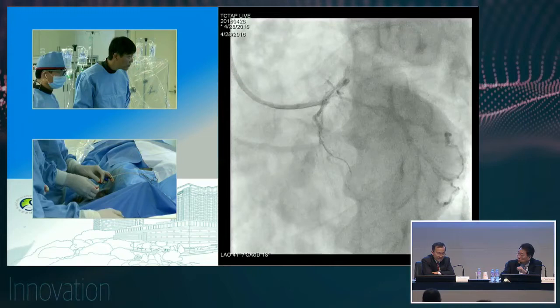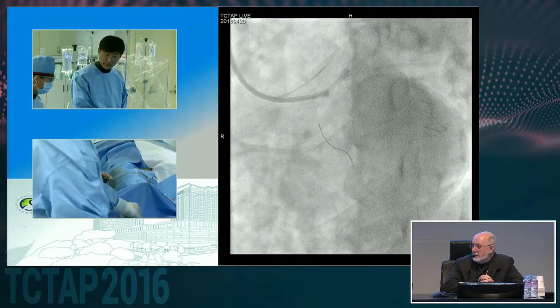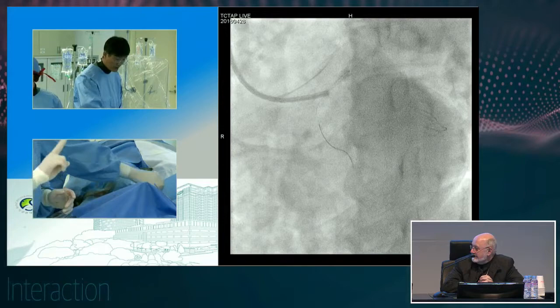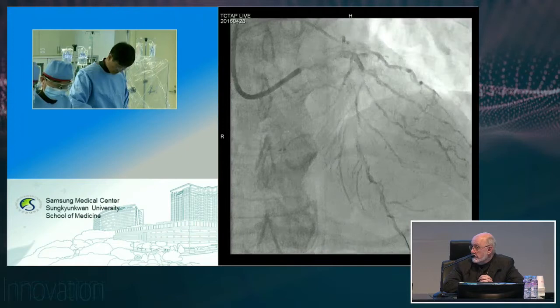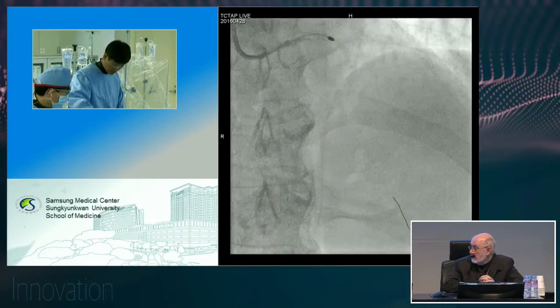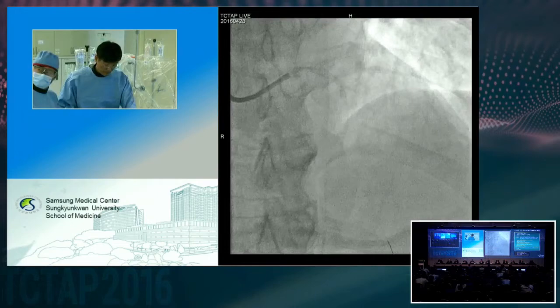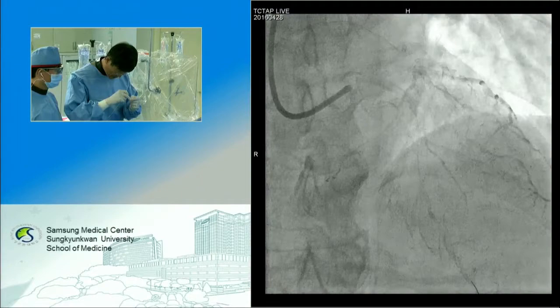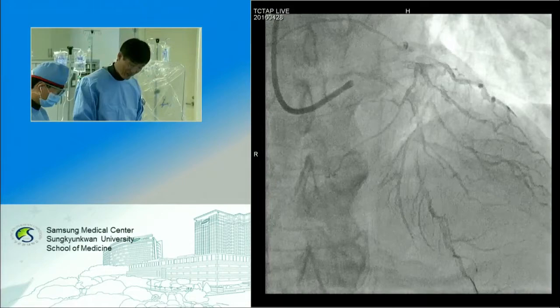Boy, that's an interesting question. Just about every Japanese interventionalist that I know has a couple of DCA catheters in their office. But it's not available. I mean, it's not made. I presume that Abbott has the patent rights to manufacture it if they wanted to, but that's a major effort to restore manufacturing of a fairly complicated device. I think it's probably more likely that the 3.0 20 millimeter Euphora. I think they insist that this Medtronic stent has the best rewrapping profile. I'm not sure, but they insisted.